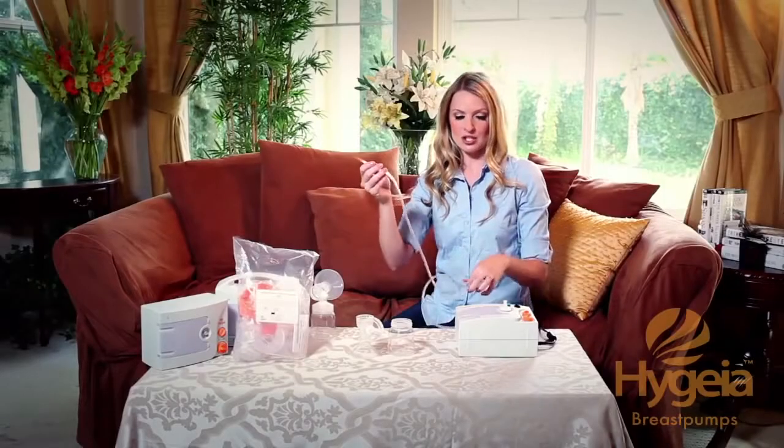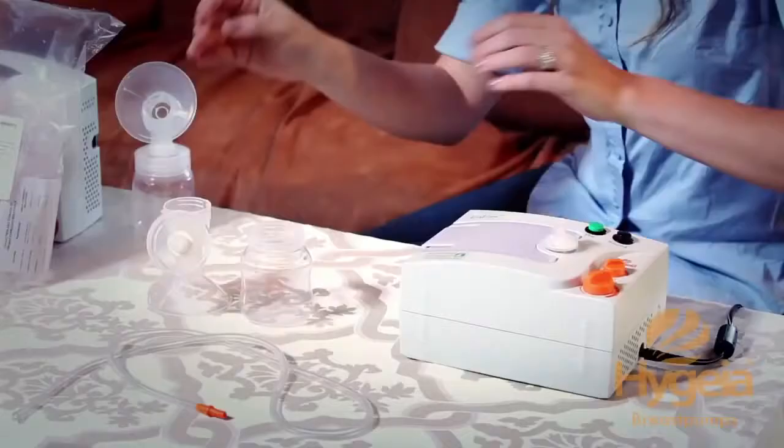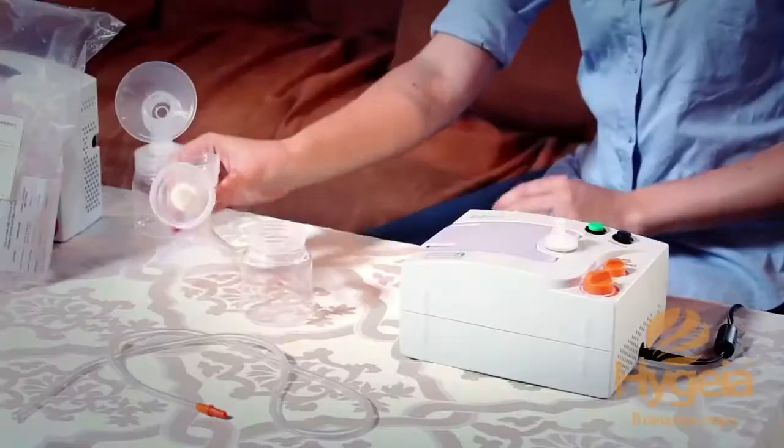We'll start with the tubing. Check to make sure it has no obstructions. Next, take the flanges and make sure the white duckbill valves are inserted snugly. You will notice that these separate and a tight fit is needed. Then screw the collection containers into the flanges.